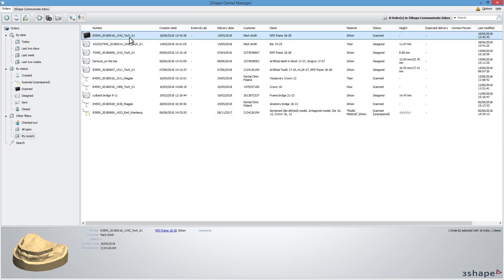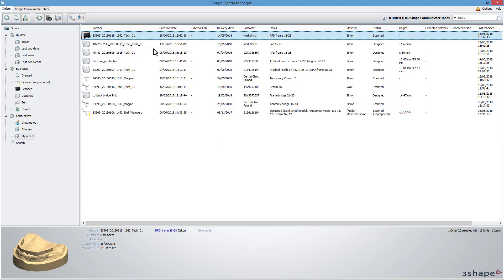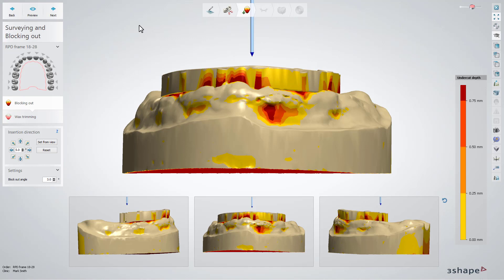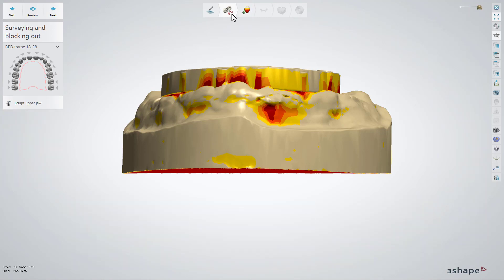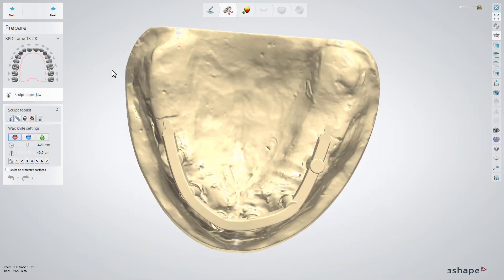Right-click the case and choose Design. Dental Designer will open. The model with the bar will be visible as a gypsum model. The software will take you straight to the Insertion Direction step — go back to the Prepare step first.